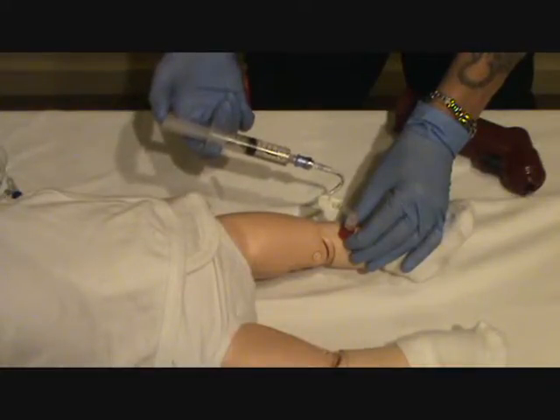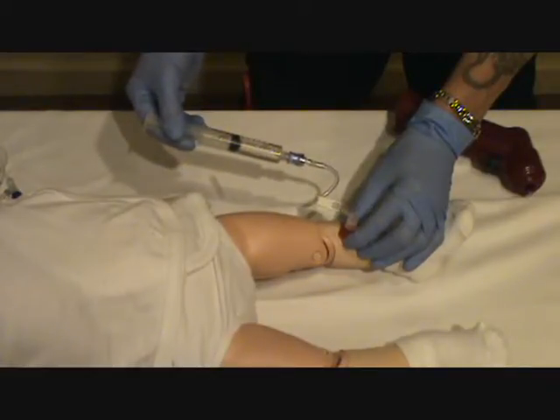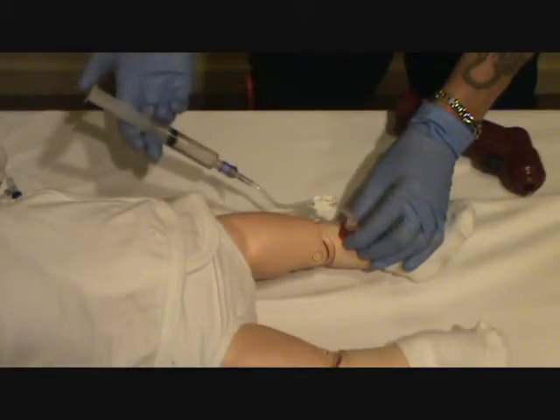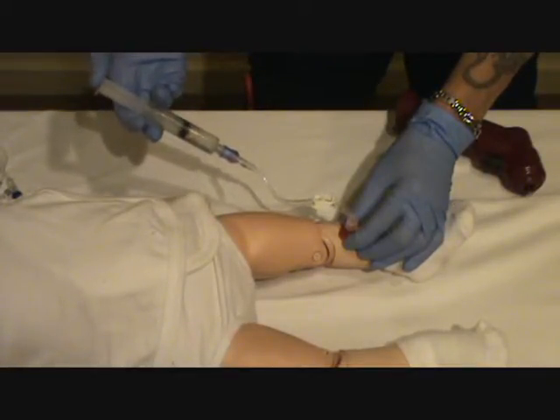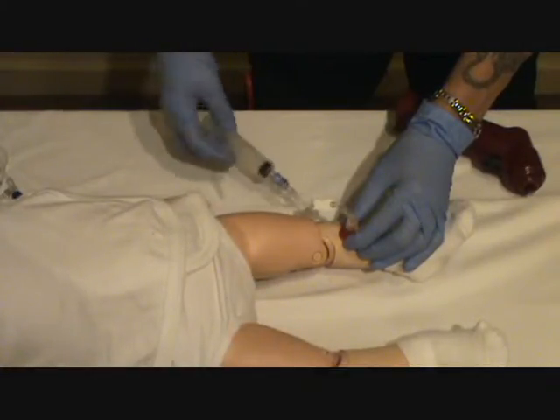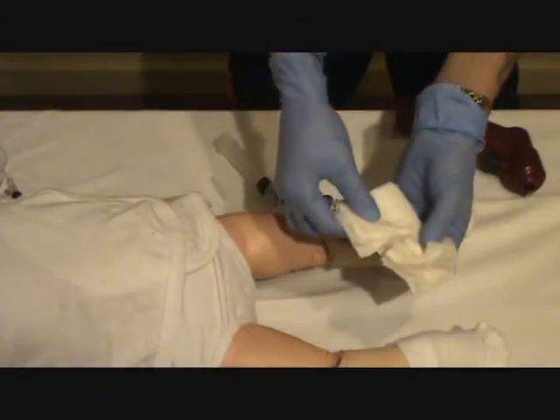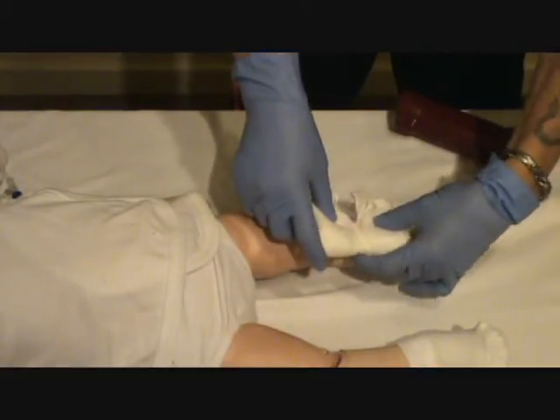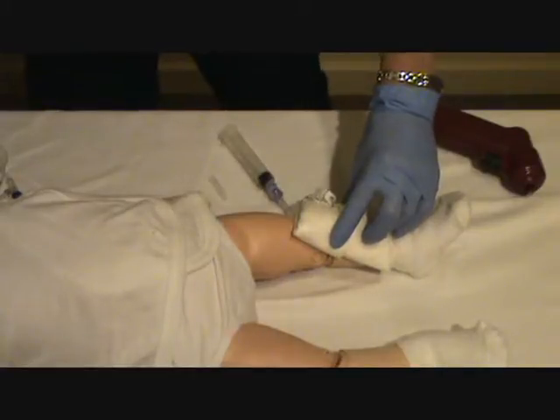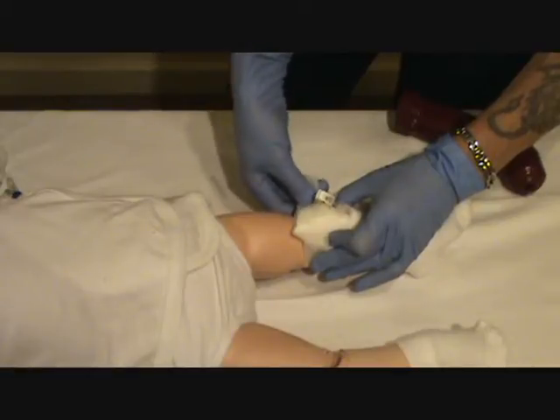push 2 cc's, make sure you have even flow, withdraw to help confirm placement by identifying blood return or marrow return, and then insert approximately a 10 cc syringe bolus. At this point, we want to secure the needle set. We use a bulky dressing secured using tape, making sure not to use circumferential tape to cut off any circulation.